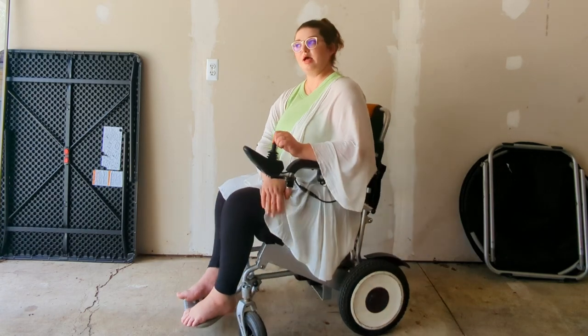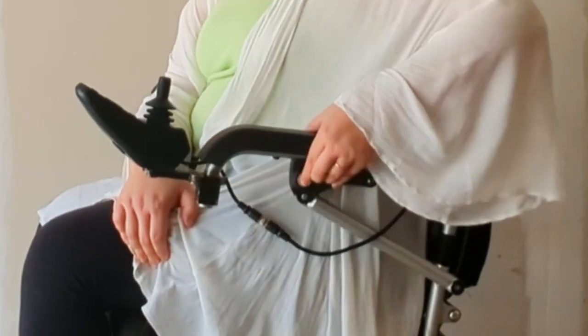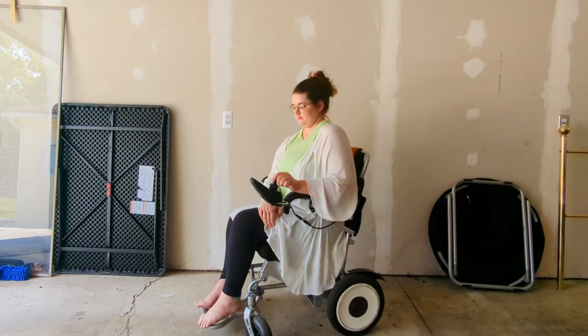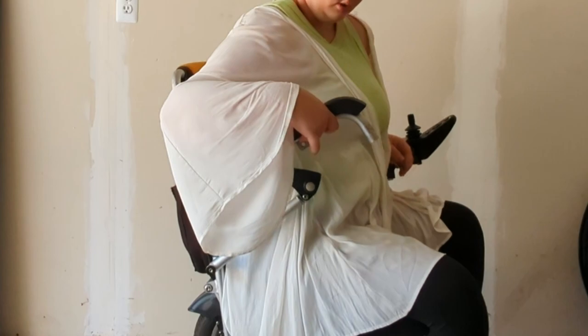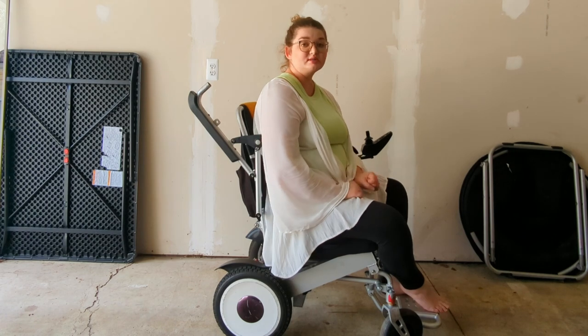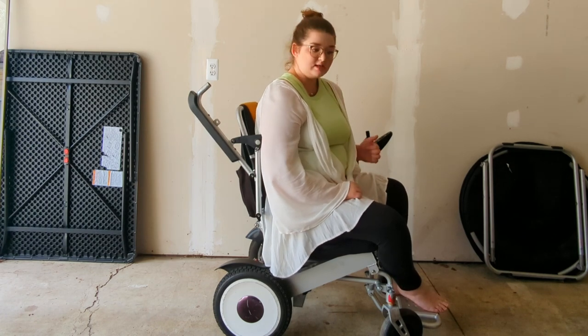This chair also has flip-up armrests. There's a button here — you push it and then pull up, and the armrests go completely up. The other side does it too: push in and pull up. This is a really good feature. I can more easily transfer in and out of my chair when I need to with the armrests up.